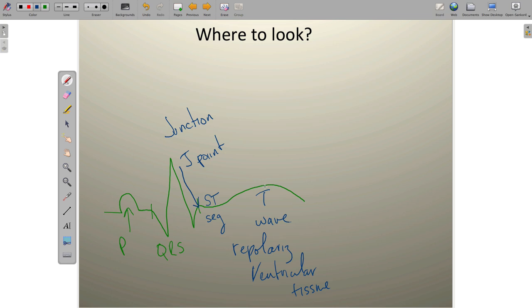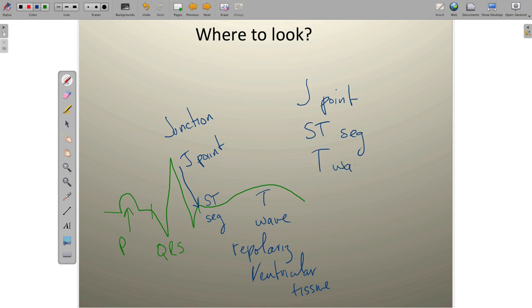When the myocardium is ischemic, a couple of changes occur on the EKG, but most are isolated to the J point itself, the ST segment, and the T wave. So when looking for myocardial ischemia on the EKG tracing, we're going to focus on the J point, the ST segment, and the T wave. There will be some other changes to the QRS complex, and perhaps even to the P wave and PR segment, but the majority of findings during myocardial ischemia are limited to those three areas. Let's explore each one in depth.